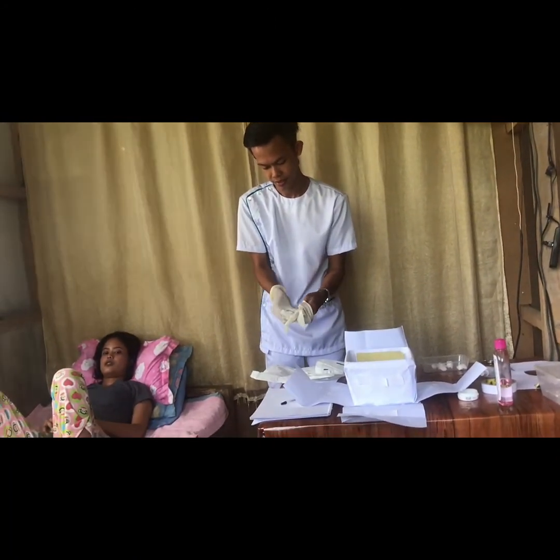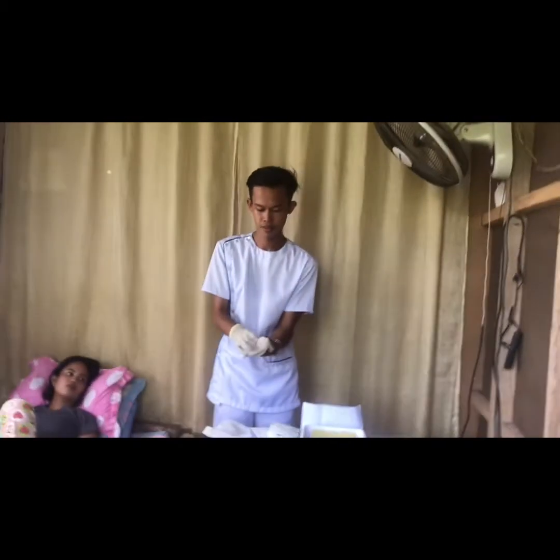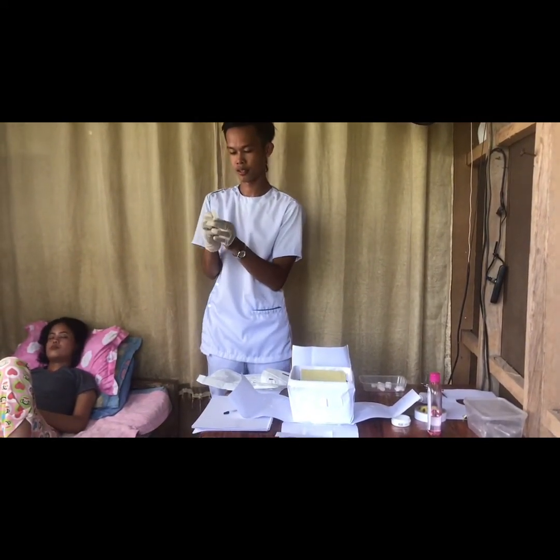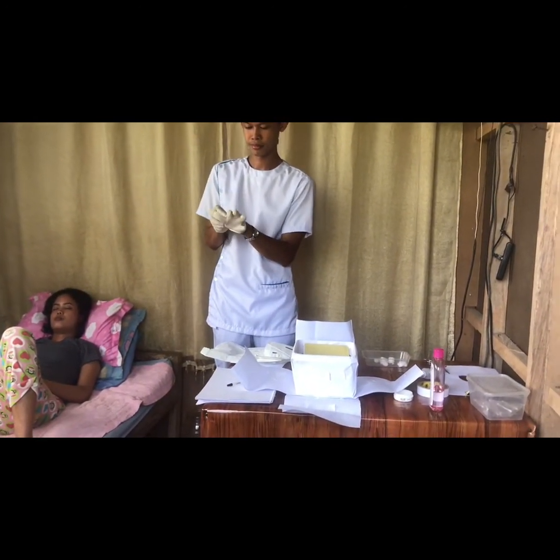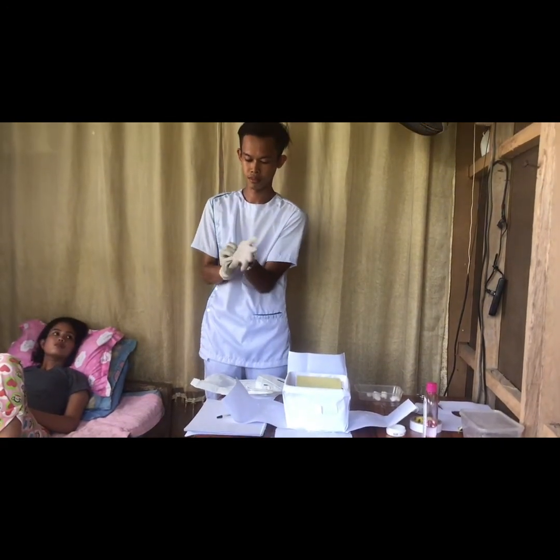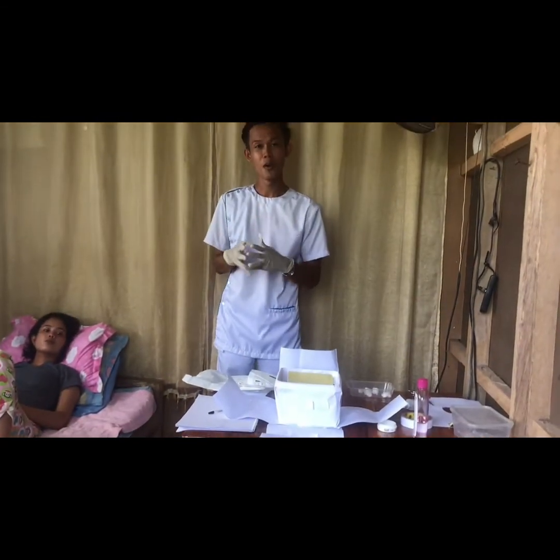Okay. So for this time, I am able to wear my sterile gloves.